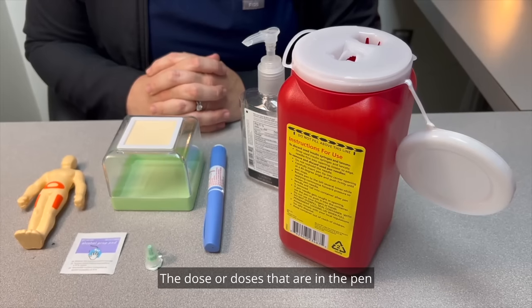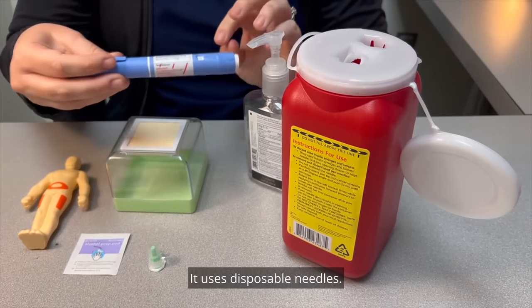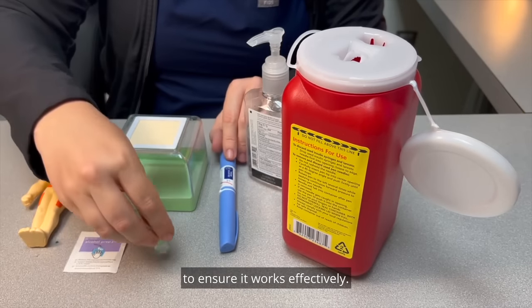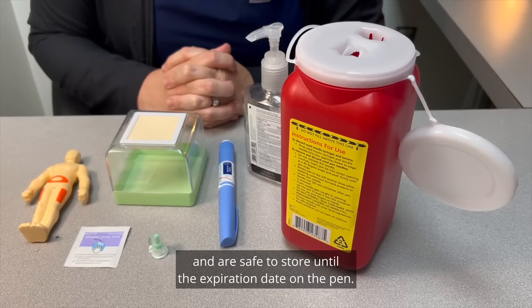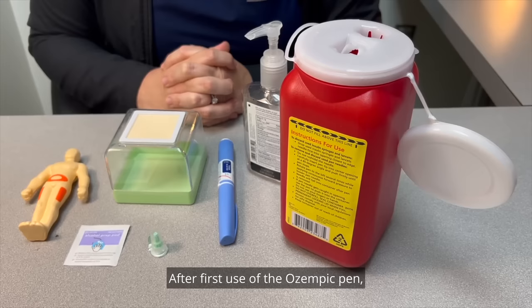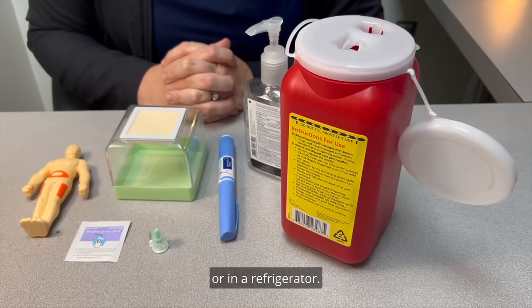The dose or doses that are in the pen will be written on the label. It uses disposable needles. It is important to store your pen properly to ensure it works effectively. Unopened pens should be kept in the refrigerator and are safe to store until the expiration date on the pen. After first use of the Ozempic pen, the pen can be stored for 56 days at room temperature or in a refrigerator.